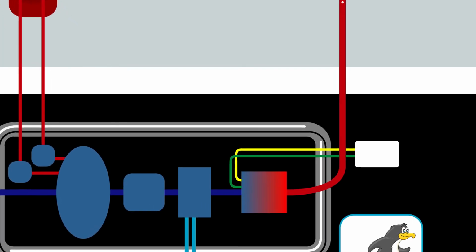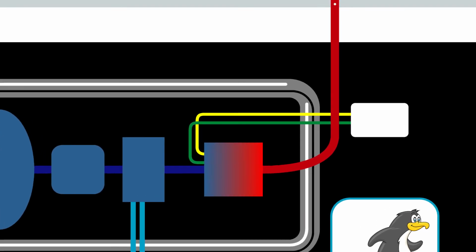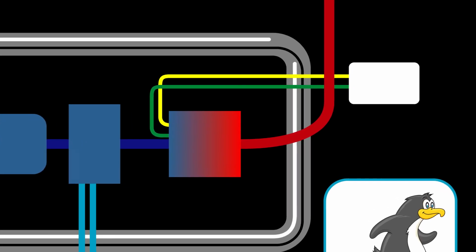This combination of limiting oxygen while at the same time denitrogenating the blood results in the sum of the partial pressures of all the remaining dissolved gases being lower than atmospheric pressure. Bubbles dissolve.